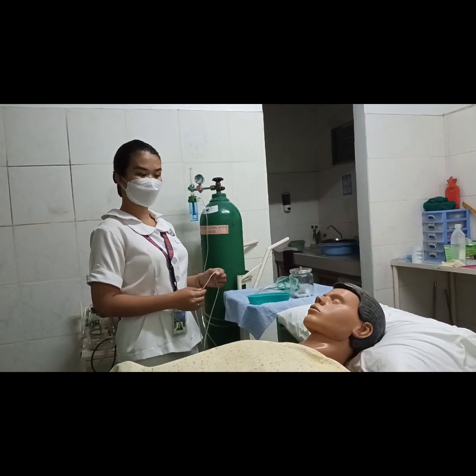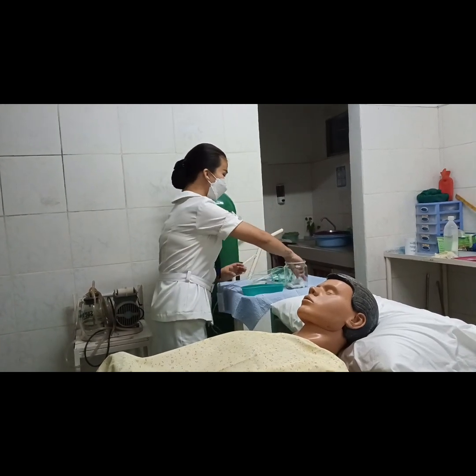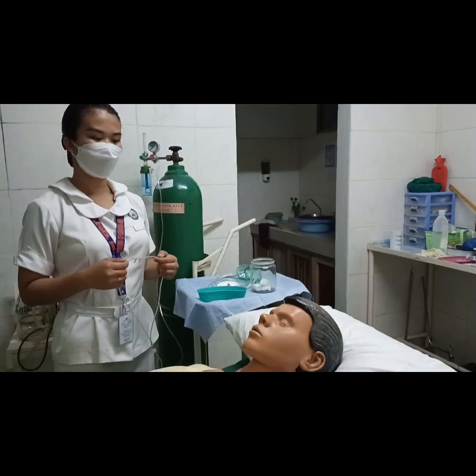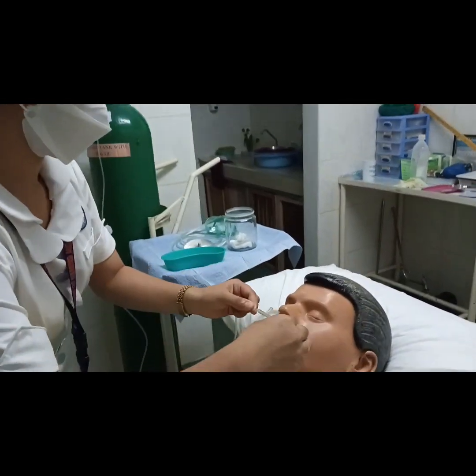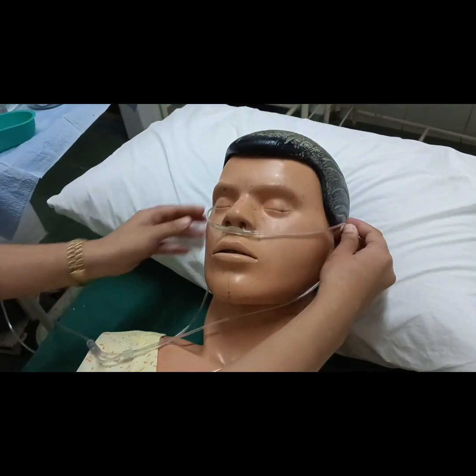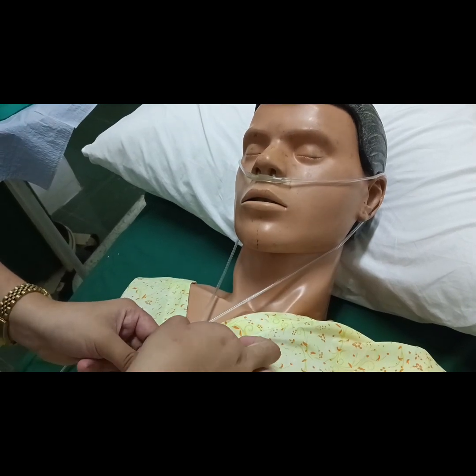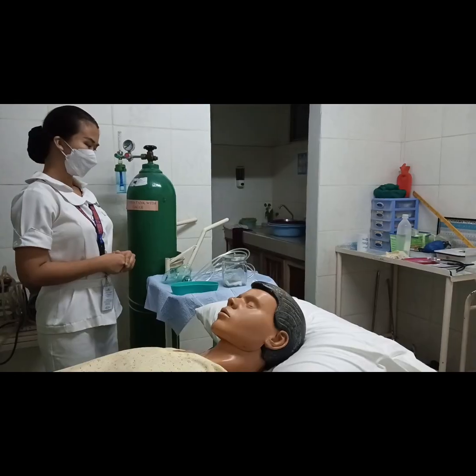For the nasal cannula, I'm going to clean the nostrils of secretions with moist cotton balls. Next, I will place the cannula prongs into the client's nose, directed upward, loop the tubing around his ears and under his chin, then tighten the tube to secure the cannula.